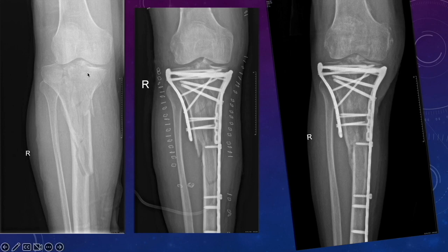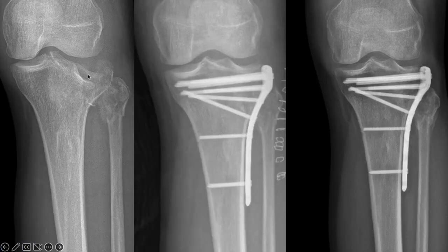And this was also a comminuted fracture in which there is depression on the lateral condyle. Again, we have provided a raft of multiple locking screws. This healed well without any complication. And in this case, there is gross depression. There are multiple depressed fragments, and there is impaction of the bone here. We have lifted the depression, placed multiple raft screws to support the depressed fragment, and no bone graft substitute or bone graft was used, and it also healed well without any complication.